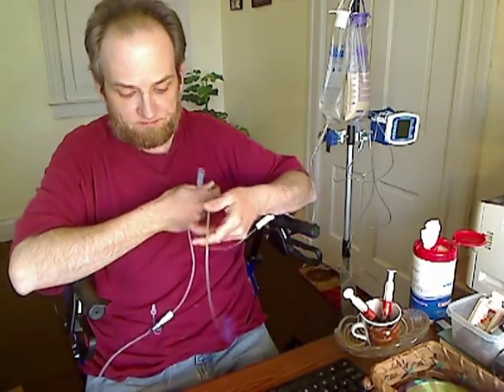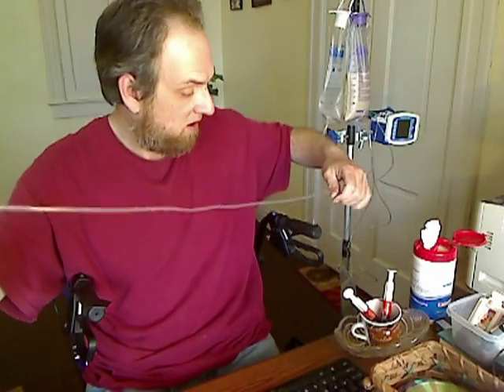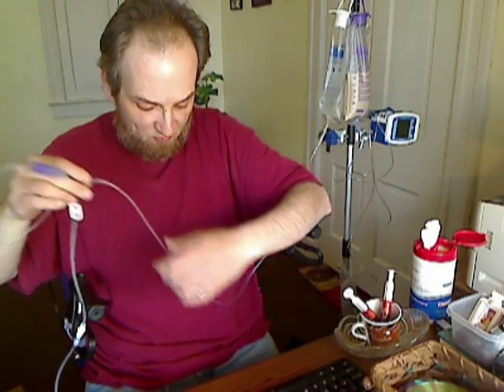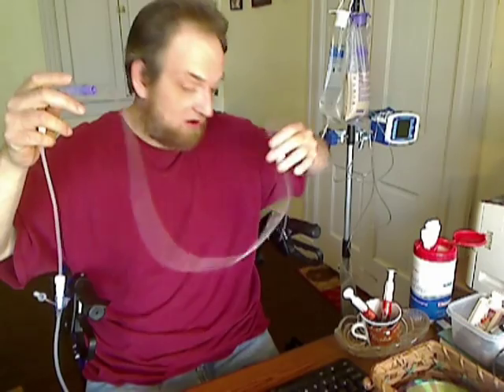Now I take my distilled water bag, I plug it in here. So now we're connected. I'm going to make sure everything is closed here. Okay, that's good. The stomach is closed. The water bag is closed. I'm going to go ahead and open my water up. Okay, so now my water is open.